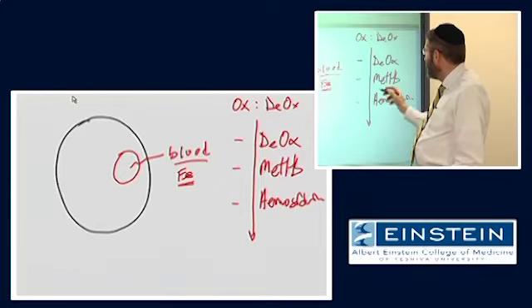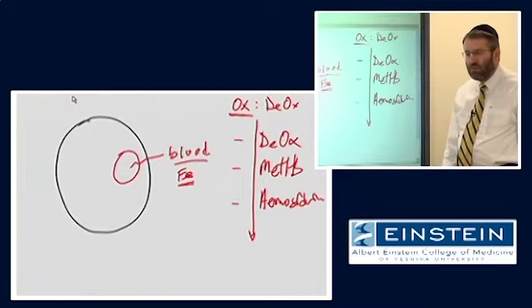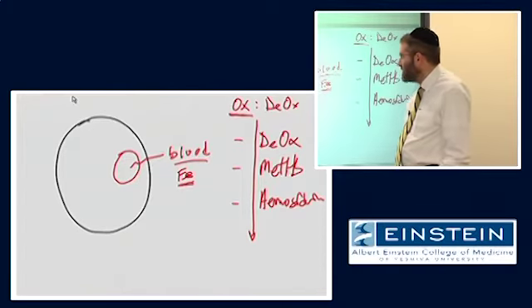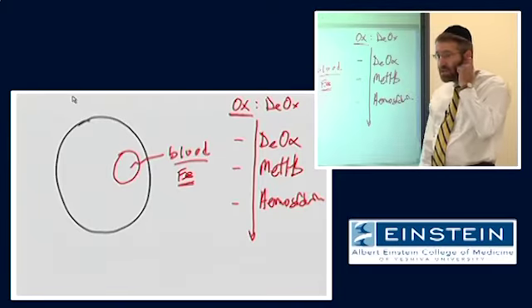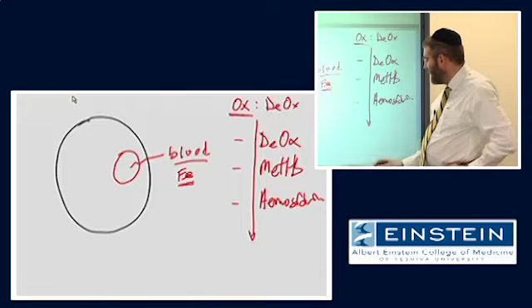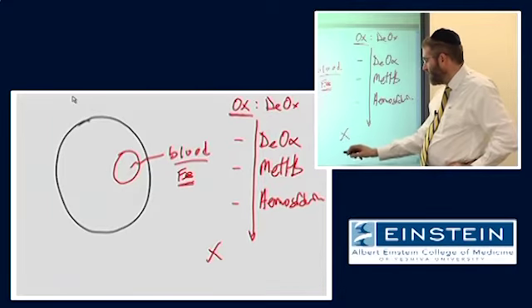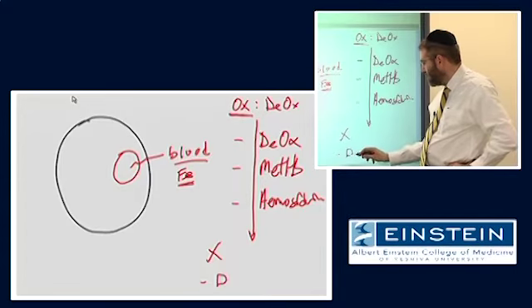For example, if we look at the case of oxygenated hemoglobin, which is something you'll probably never see because it takes so much time for the patient to ultimately get into the scanner, oxygenated hemoglobin on our magnetic susceptibility scale is actually in the negative range. It's a diamagnetic molecule.